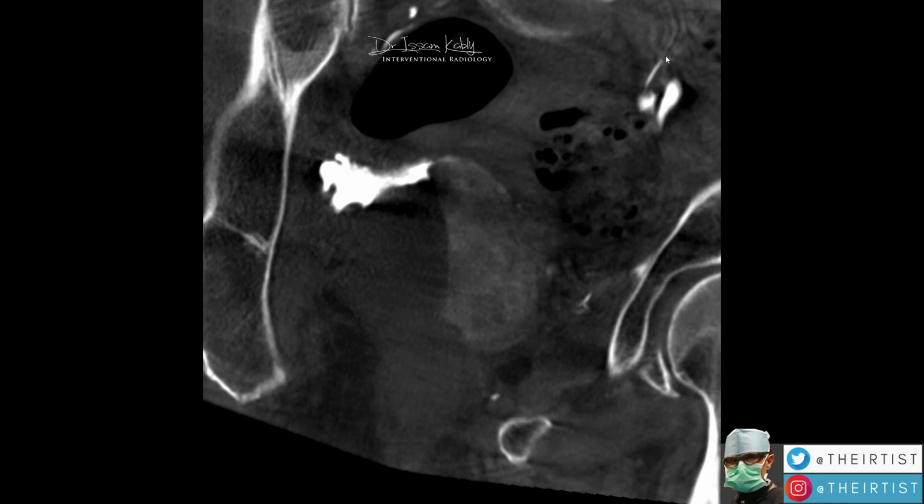We basically travel through the patient's own natural pathways, just like in a science fiction movie, and we use miniaturized material, almost microscopic, to perform an intervention that is well tolerated by this gentleman of quite advanced age. He's 87, but that's not the problem. I have treated 87-year-olds who are in good shape.